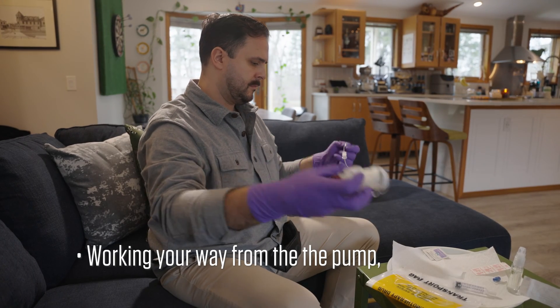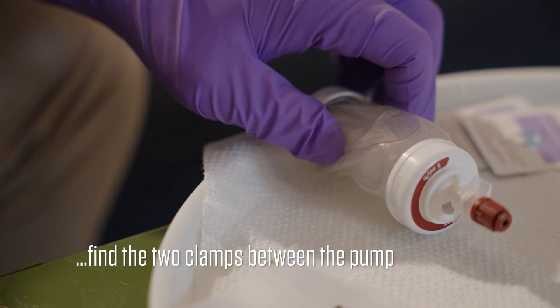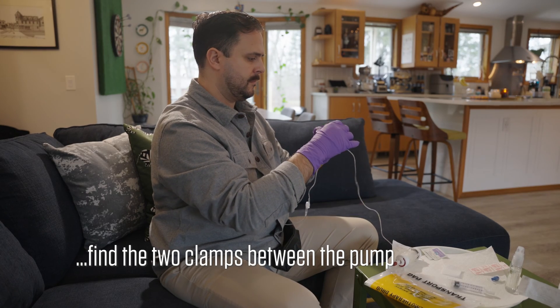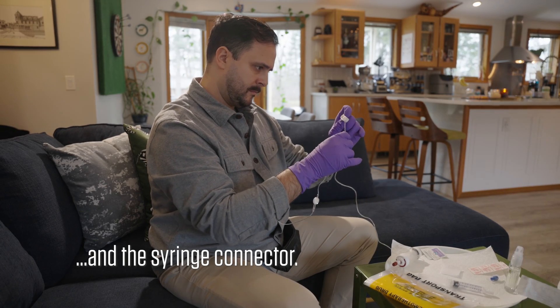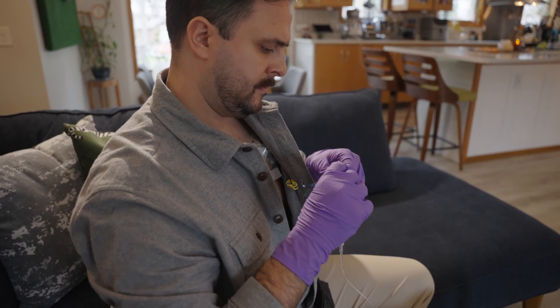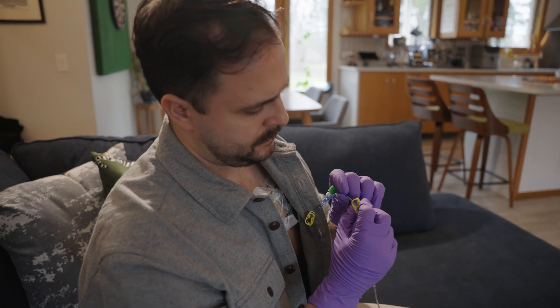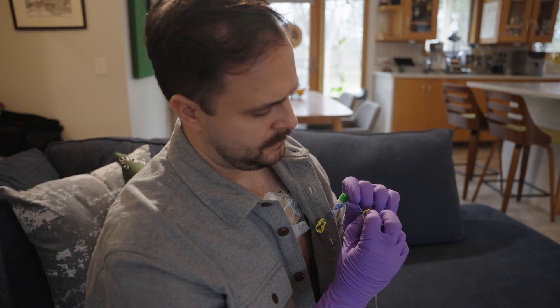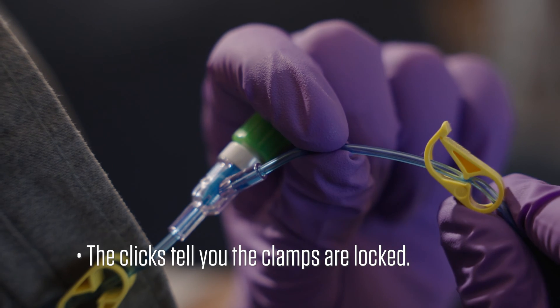Working your way from the pump, find the two clamps between the pump and the syringe connector. Pinch both clamps closed to lock them in place. The clicks tell you that the clamps are locked.